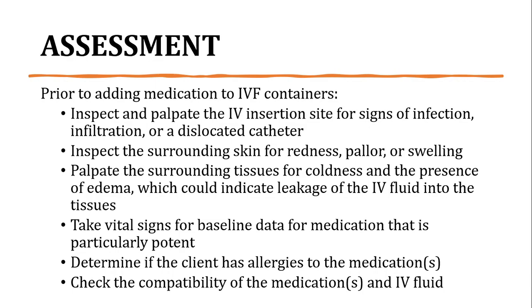The assessment. Prior to adding medication to intravenous containers, inspect and palpate the intravenous insertion site for signs of infection, infiltration, or a dislocated catheter. And inspect the surrounding skin for redness, pallor, or swelling. And palpate the surrounding tissues for coldness and the presence of edema, which could indicate leakage of the IV fluid into the tissues.